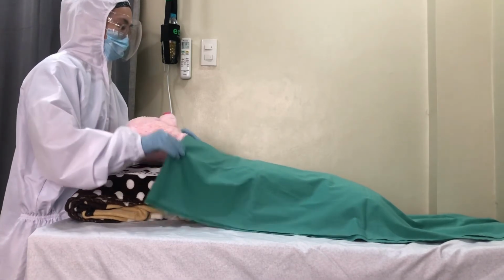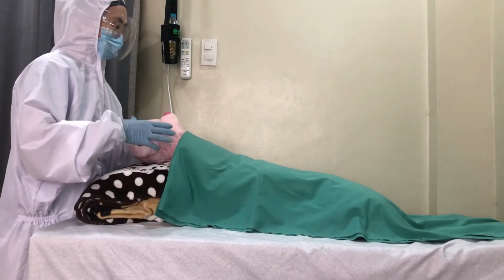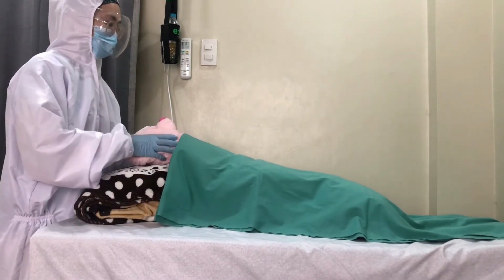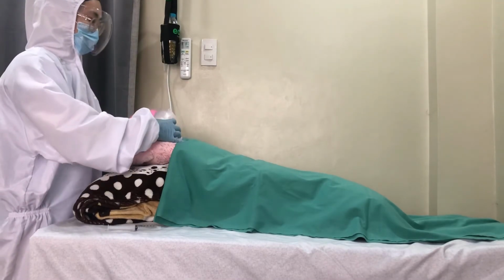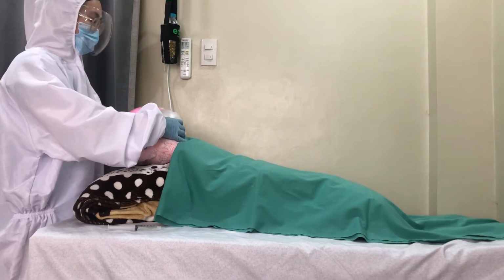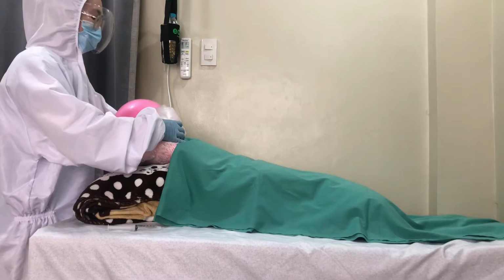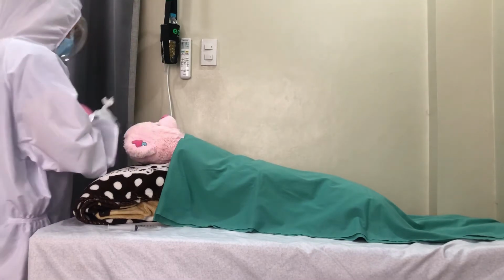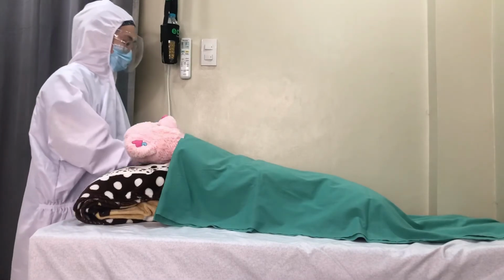If the patient is hemodynamically stable, the operating table should be tilted in a reverse Trendelenburg position to decrease pressure on the diaphragm. We will pre-oxygenate the patient again by applying the tight-fitting bag valve mask and pre-oxygenate until the oxygen saturation is 100% and the end-tidal oxygen is greater than 90%. After pre-oxygenating the patient, succinylcholine is then given.